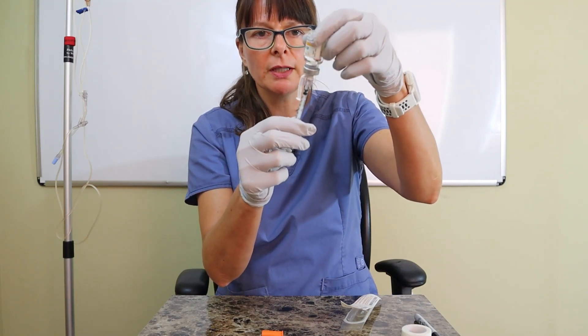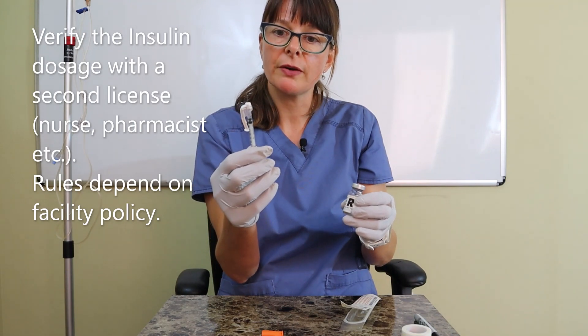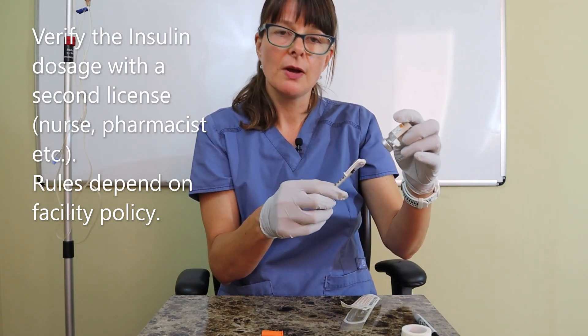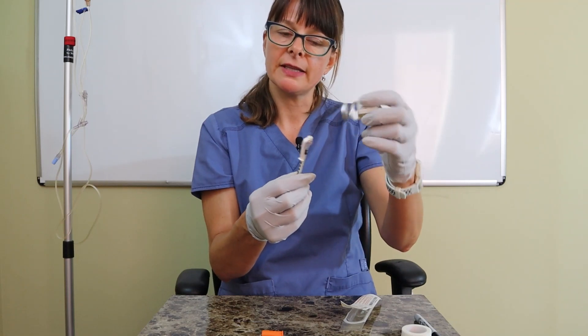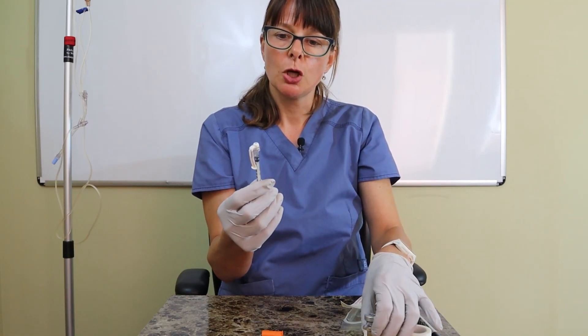Double-checking the 10 units. Typically you need a second nurse to verify your dosage, so you would leave the needle in the vial and have somebody else verify before you're okay to use it.